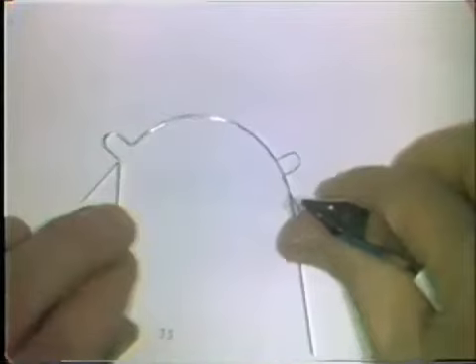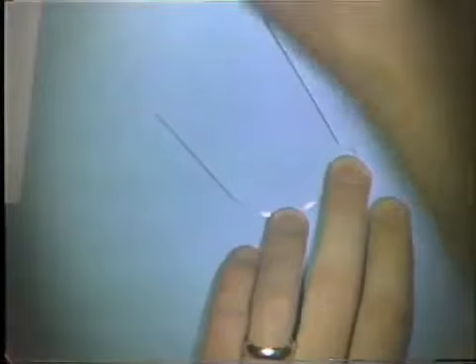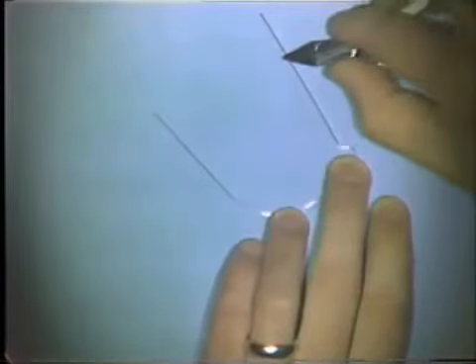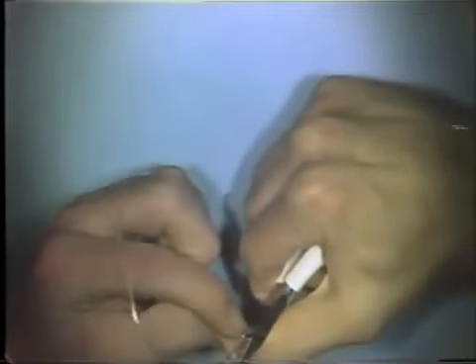Also, at this point, you check the flatness again to see if the loop and the curvature are still flat in relationship to the tabletop, and if your latest bend is causing the flatness to deviate. We need a little adjustment of this wire downward towards the table surface to bring it into the same plane of space as the loop and the curve.